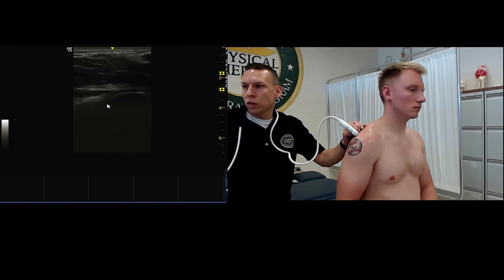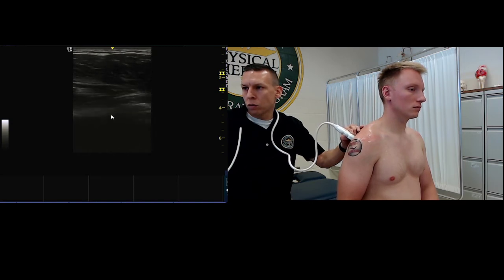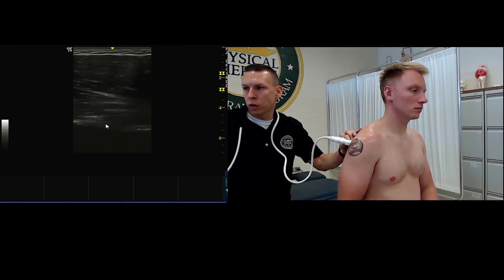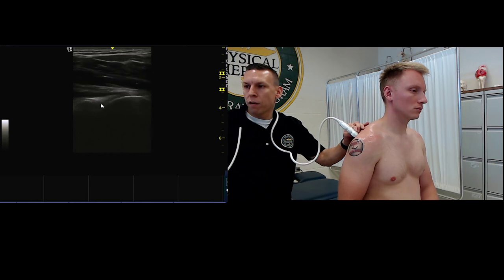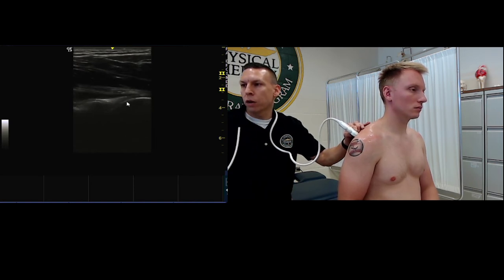And we want to scan superiorly. This is the humerus, glenoid, labrum. And we want to scan distally until we run out of the distal portion, so we can see we're almost coming down close to the quadrangular space. But here we're looking for any kind of fluid accumulating, any perilabral cyst that might compress the suprascapular nerve.